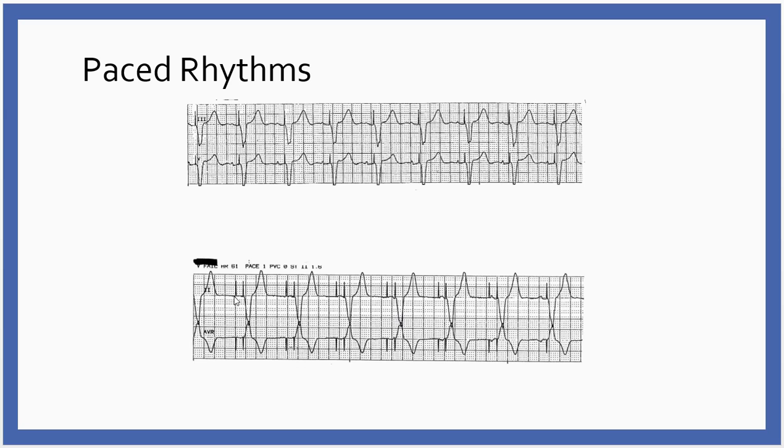And then it waits for a prescribed programmed length of time, usually the equivalent of having a PR interval of 0.20, so it's 200 milliseconds. And if there's no stimulus to the ventricle, then it'll stimulate the ventricle, and then we see our wide QRS and our T wave, our ventricular capture. Now, one thing you notice about this strip, there's something interesting that happens at the end of the strip. Before I point it out, go look at that last complex and see what you see. What do you think?